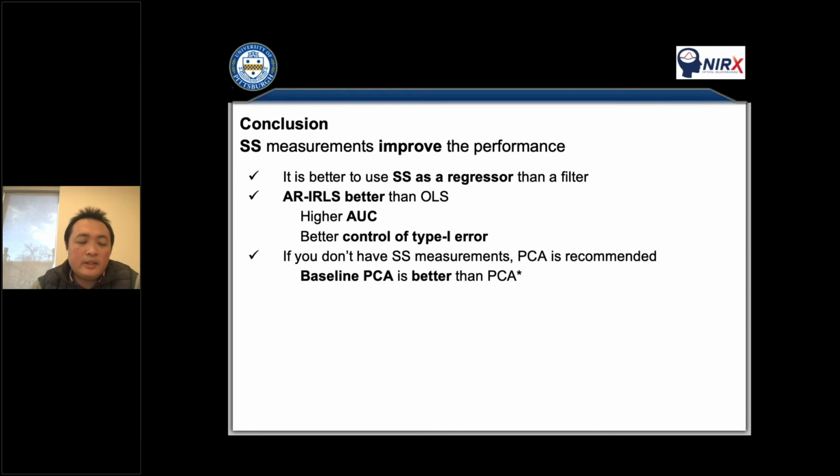And then the last one: if you don't have short separation measurements, you can contact NIRx if you have a NIRx system. But if you don't have that system, you can use PCA. It is better to use baseline PCA.